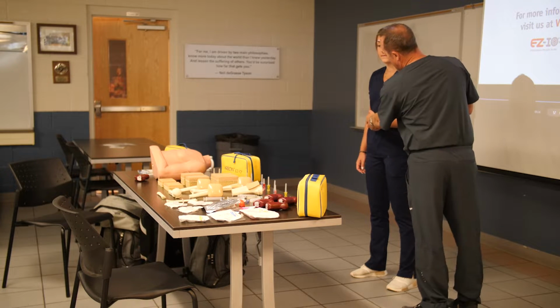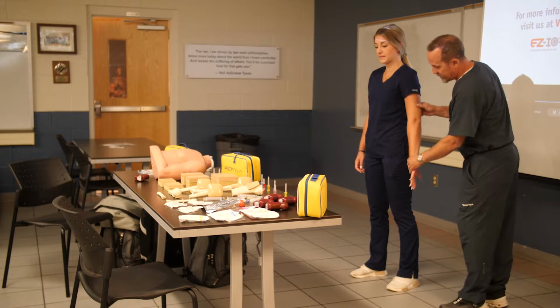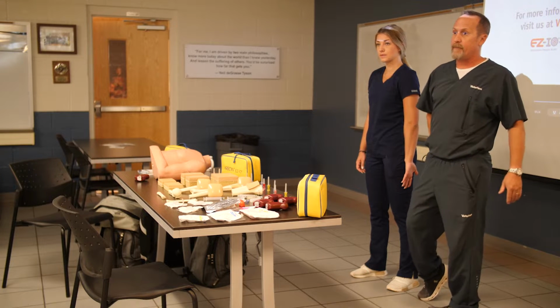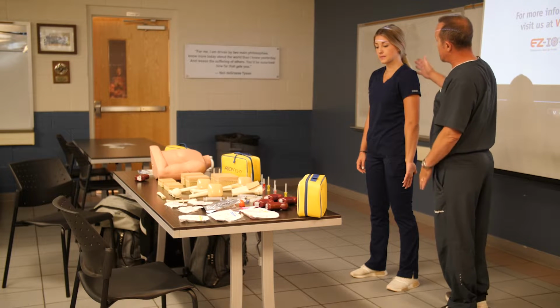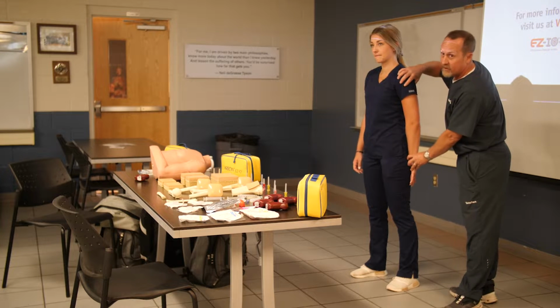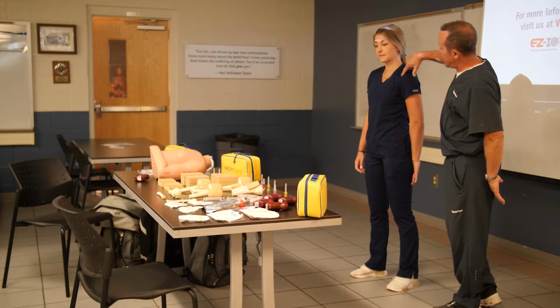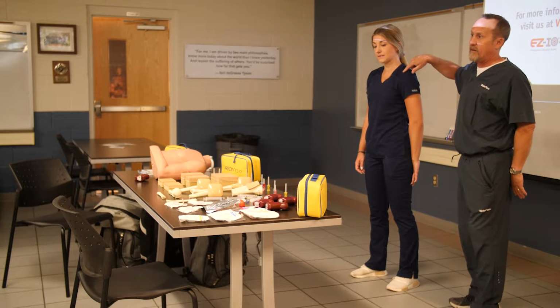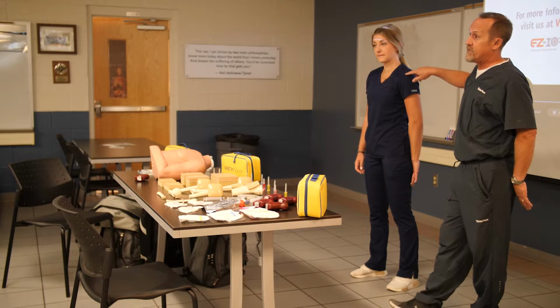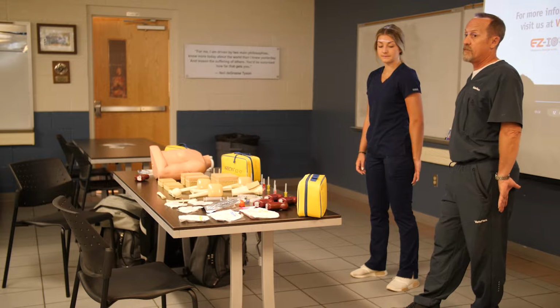So what we recommend is you actually take the patient's arm directly to their side, and we're going to turn their thumb posterior, okay? So I always say thumb to the bum. And the nice thing about this, when your patient's laying flat on their back, if we put them in this position, you can even tuck their hand up under their butt and it kind of stabilizes it. But as you can see, her proximal humerus kind of punches out right here when I put her arm in that position. So it makes it really, really easy to identify, okay? So we're gonna go hand to the side, thumb to the bum.